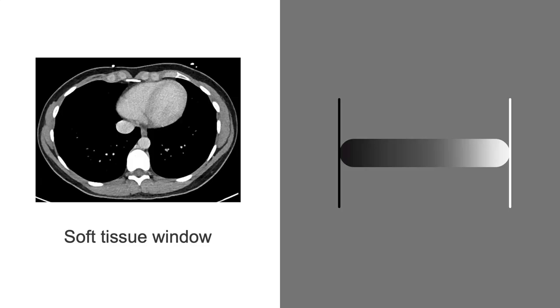Let's apply this to the soft tissue window, where the window width is 400 and the window level, or center point, is 50. This means that the grayscale is spread out over 400 Hounsfield units total, ranging from –150 to 250.